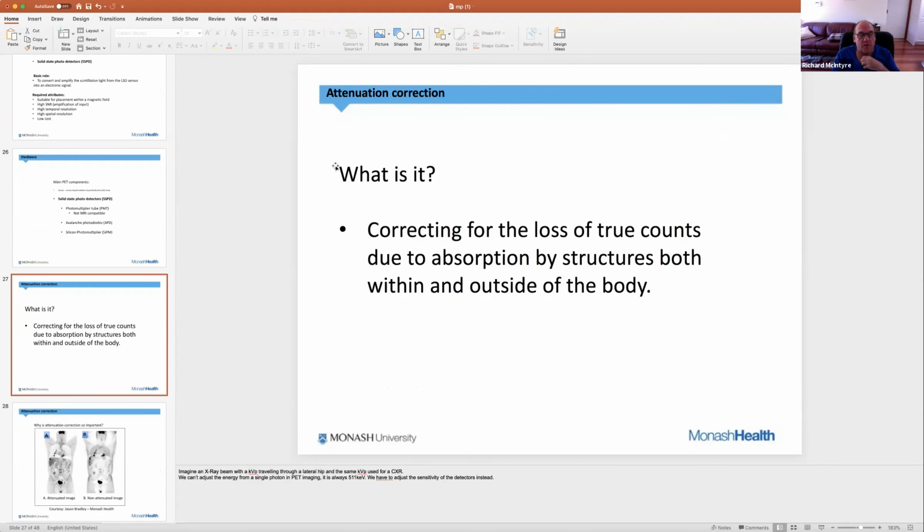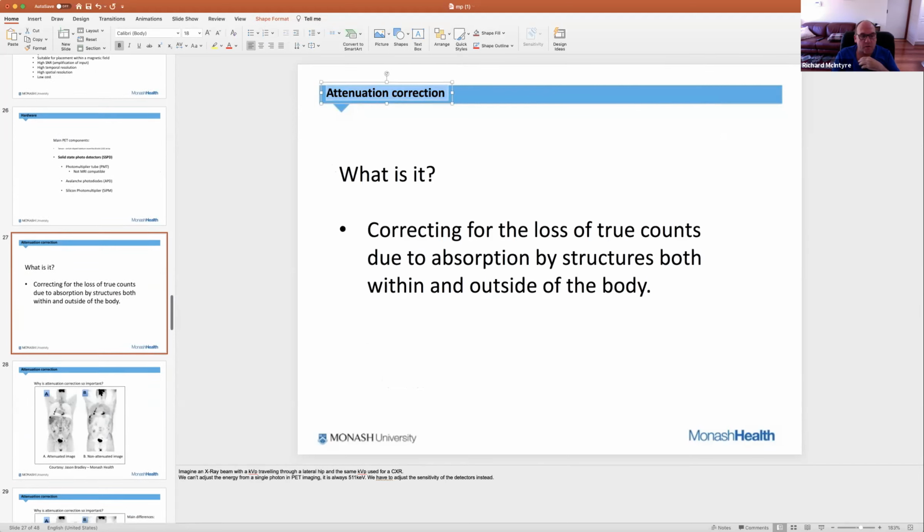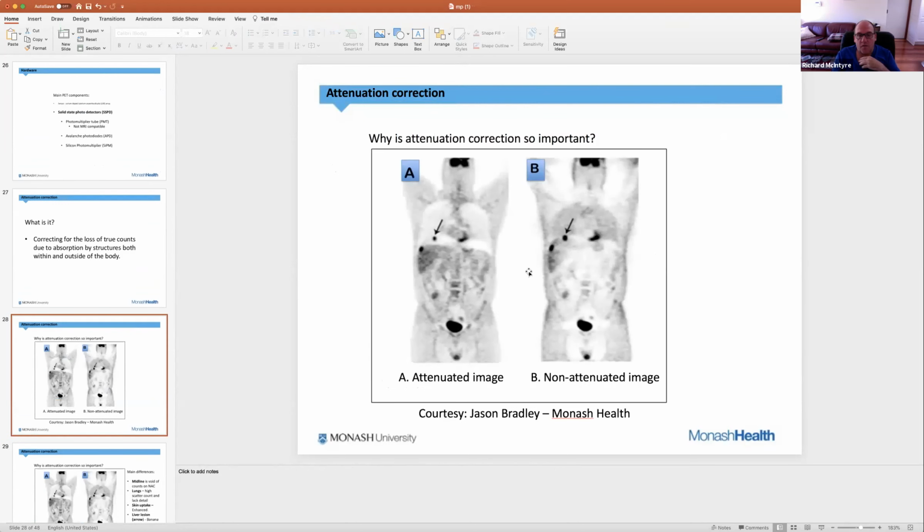So moving on, attenuation correction, okay? This is important, and this will be on the test. We've got a PET signal in here from the heart, okay? So we've got a radiation signal we know has come 180 degrees and been detected. Can we compare that detection from the heart? That signal has gone through the lungs and been detected on the outside by the ring detectors.